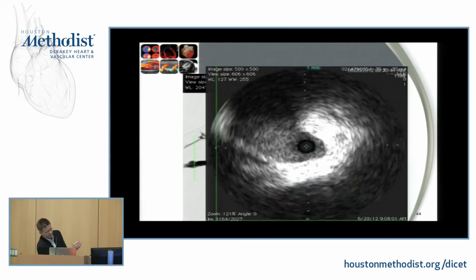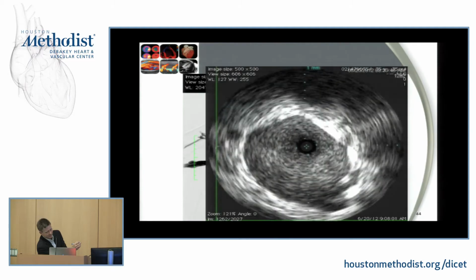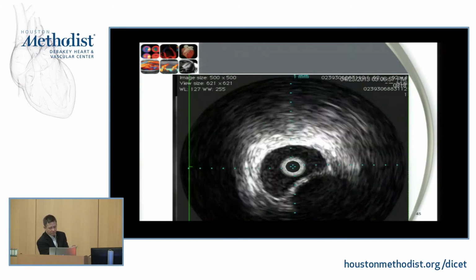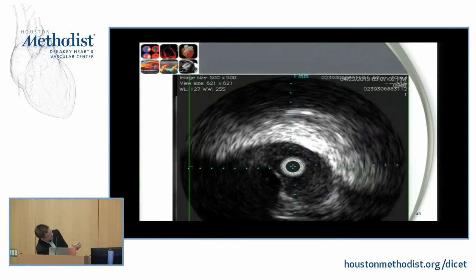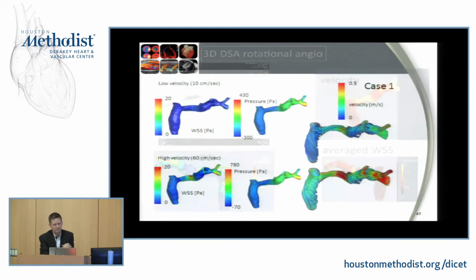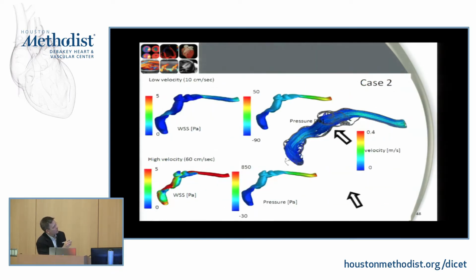Later. Let's see, actually, this next one shows one as well. So we see this big bowing and then big shadowing behind it. That's indicative of a bone, right? Because ultrasound doesn't pass through the bone. And then with our plain imaging, we can go through and do flow modeling and look at how the flow characteristics are through there and then see what that looks like.